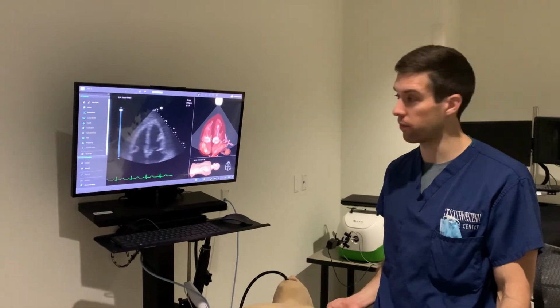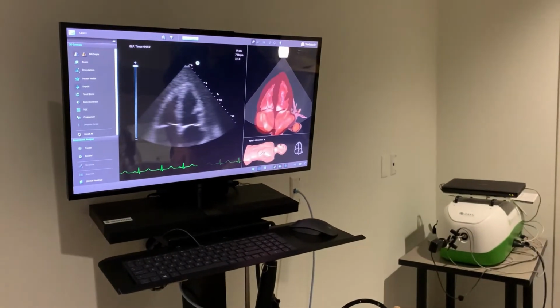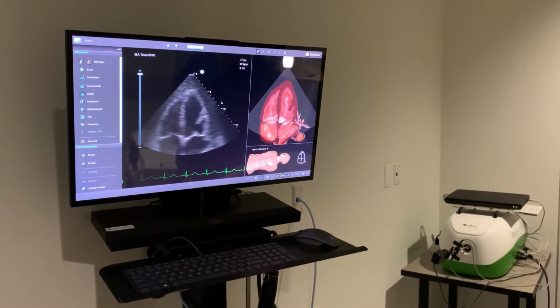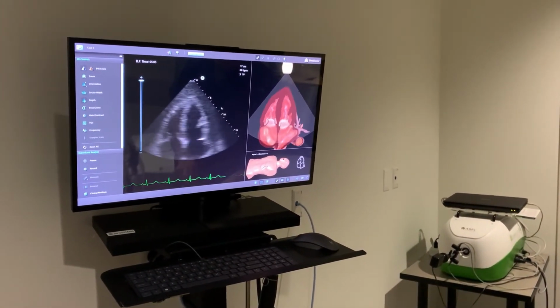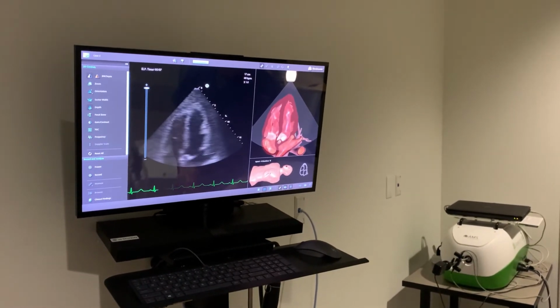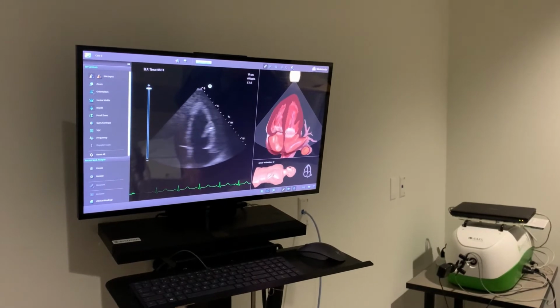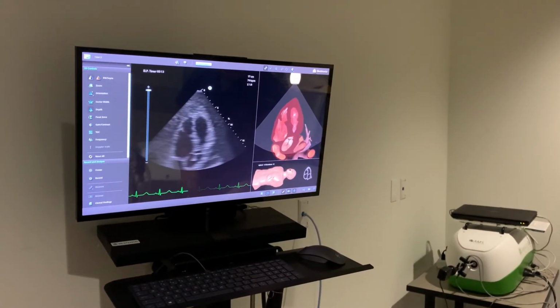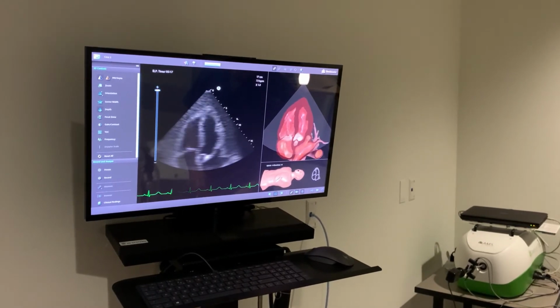Can you show us a foreshortened apical 4? Yeah, for sure. So what Spencer is saying is that a lot of times when we put the indicator probe on, we might have the probe angled in kind of a funny way, and so you might see something like this. I'm going to try to tilt it without getting the ribs in.